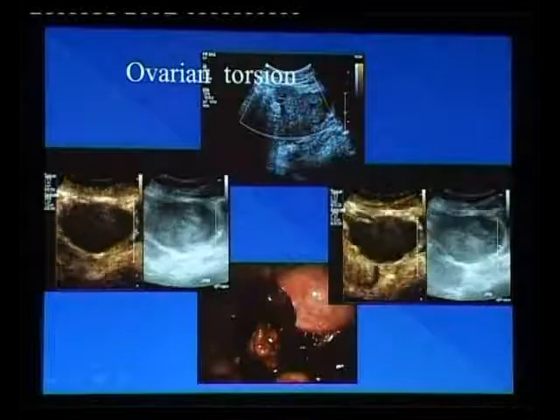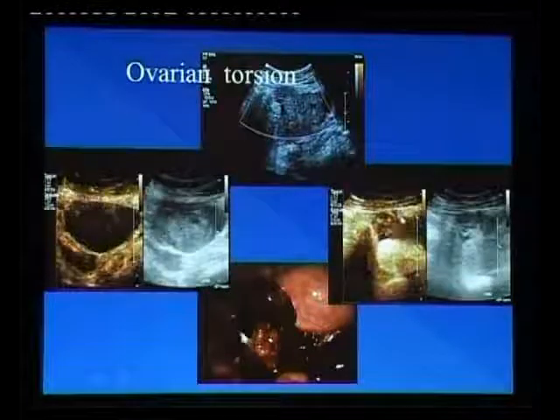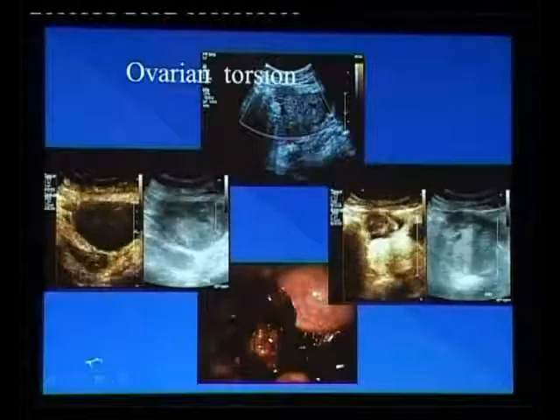And here, for example, there is no bubble going into this lesion at all, and one would expect it to be gangrenous, as we can see on the scopy.